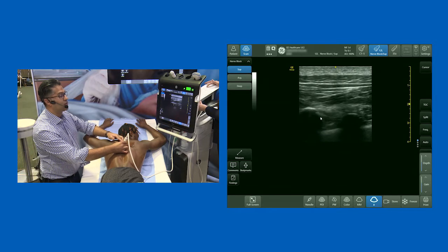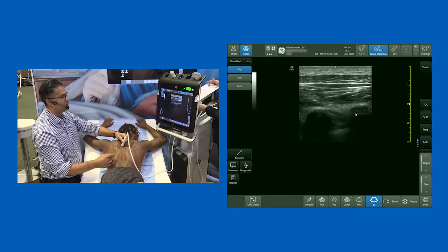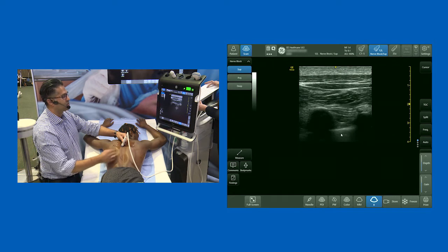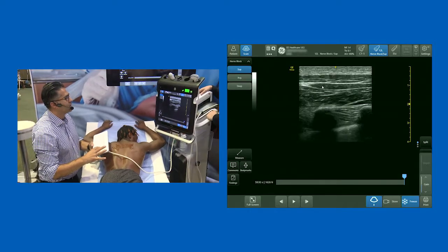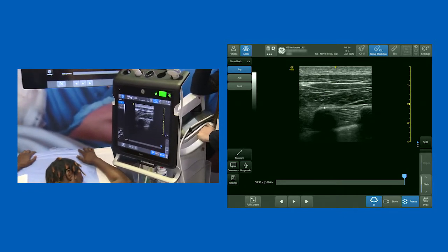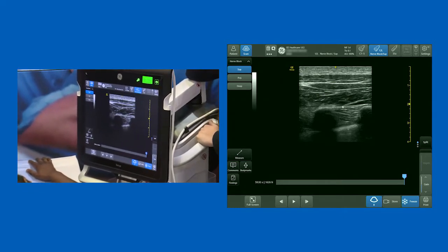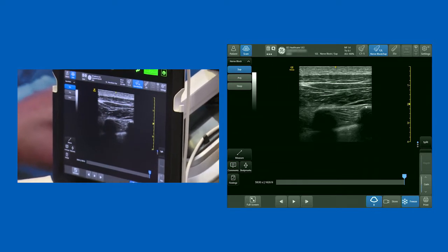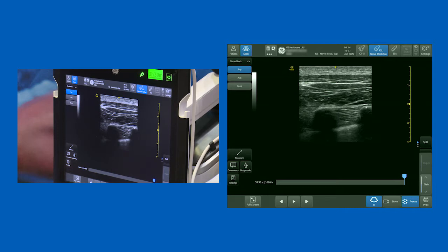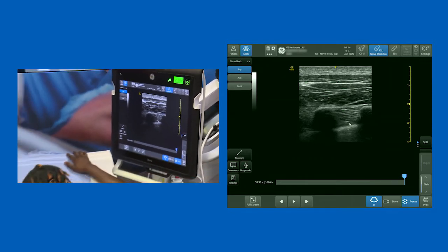I'm actually scanning on the right-hand side over a rib, and that's immediately reduced the bony impedance I've got to get down into the paravertebral space. Over here: skin, subcutaneous tissue, adipose, paraspinal muscles, transverse process on the right, and a rib because I've introduced that caudal laterality — a parasagittal oblique. We've got a nice view of the pleura down here.